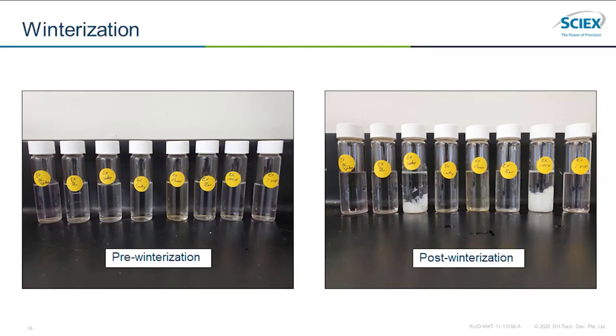There's a little bit of tint in the flour, which is in the middle, but for the most part, they look pretty clean. However, after I stuck them in the freezer at -20 degrees Celsius for about 2 hours, we've got all this fat precipitating out. So in the cookies and the chocolate, we see just a ton of precipitant.